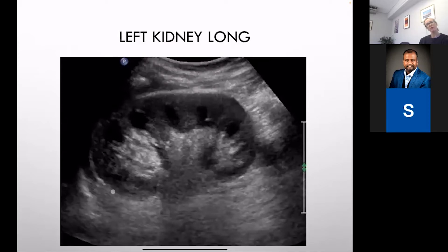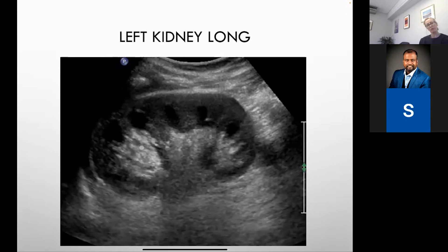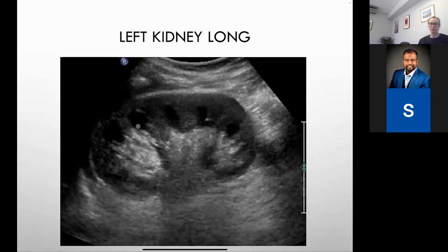On an ultrasound image, the long axis of the kidney has the marker facing the patient's head side, so the superior pole is at top and inferior pole at bottom. You have the fibro-fatty pelvis which is quite echogenic because of the fatty and fibrous content. Around it you have the relatively hypoechoic cortex and the hyperechoic capsule. Between these, there are almost anechoic structures — those are the pyramids. Normally pyramids are quite hypoechoic or almost anechoic, but with nephrocalcinosis they become more echogenic.